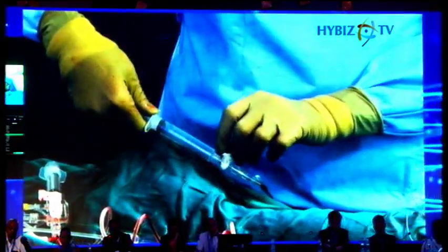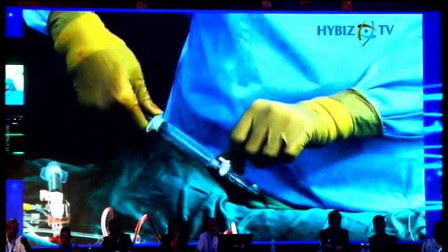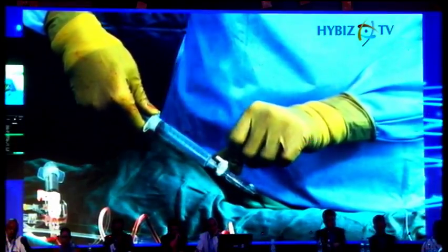contrast and a small syringe, please. With the lever lock. So you're going to take a concentrated contrast, right? 100% contrast, correct, yeah. Okay, good. And there is a fly that's bothering me a lot. Okay, good.